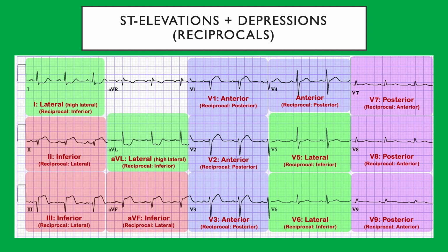This one is V7, V8, V9. Do you know where they come from? Where do you put them? On the back, good. This is your 12 lead ECG. The way I remember it is that I'm Greek, so I have a Greek pi, okay, the pi, and you know that these are the posterior, right? So V7, V8, V9 are the posterior because they go posterior, so everything else should be anterior, and then you continue like a snake, like an inverted P, so this is the inferior, and everything else is lateral. Okay, find your way to memorize it, that's how I memorized it.